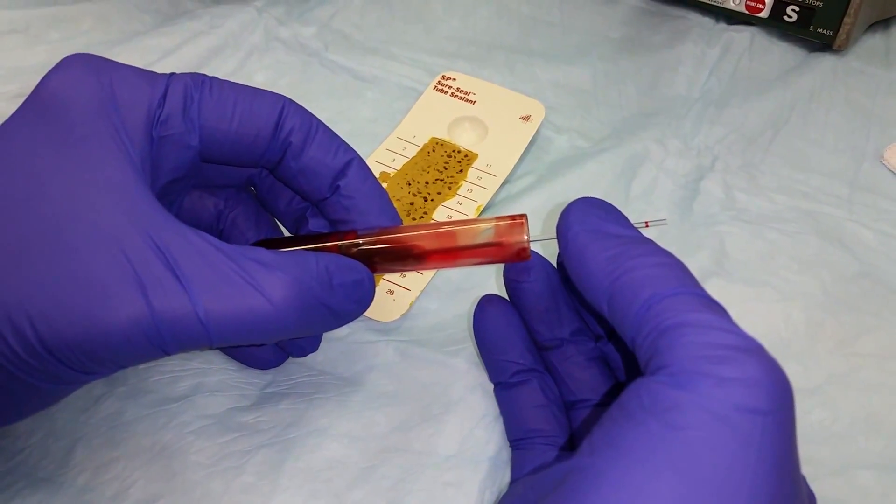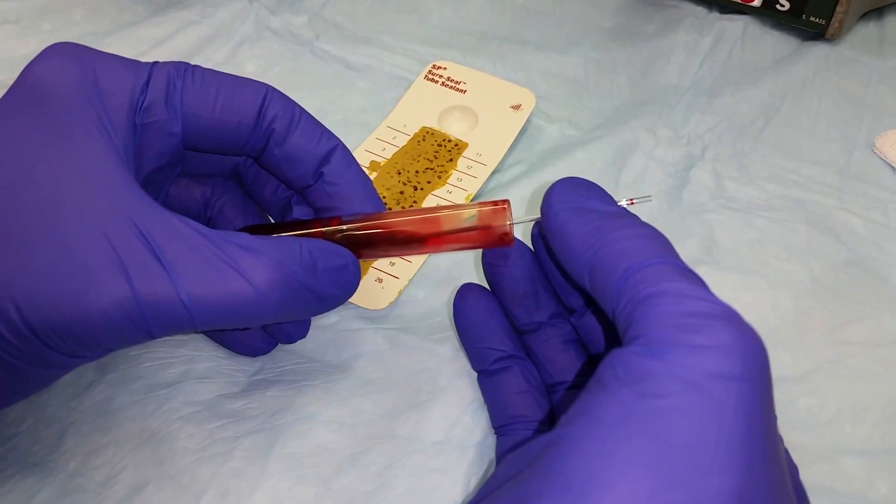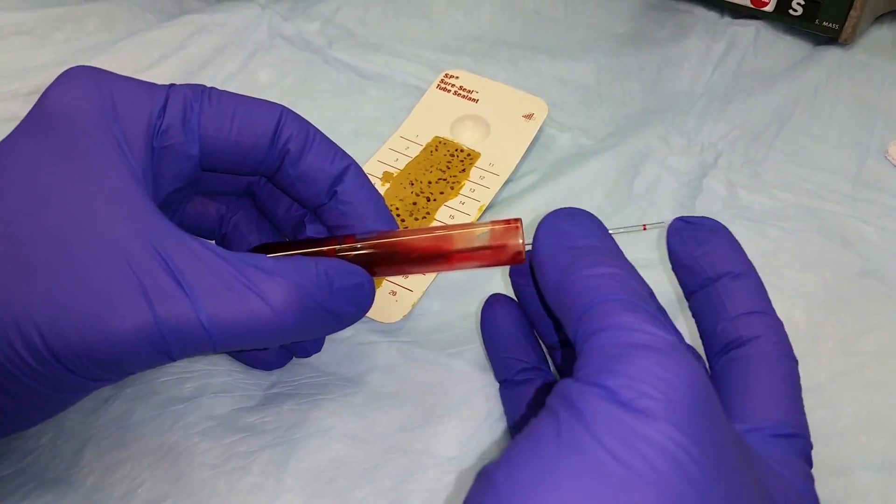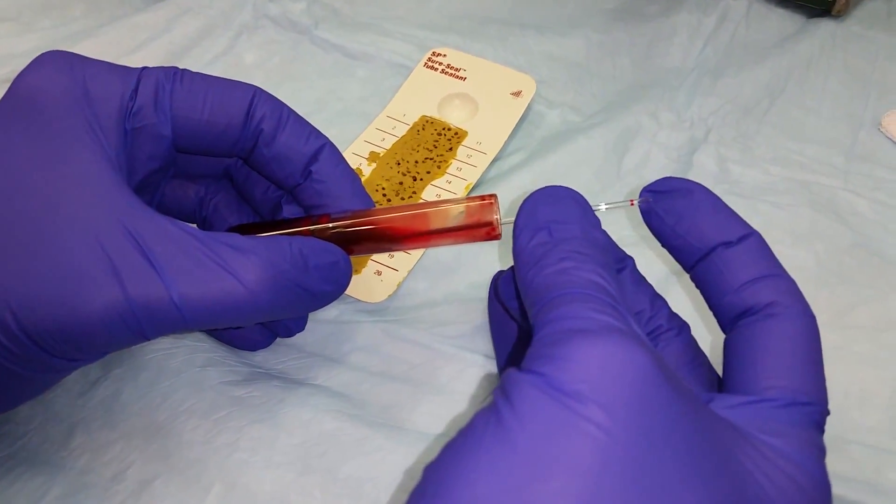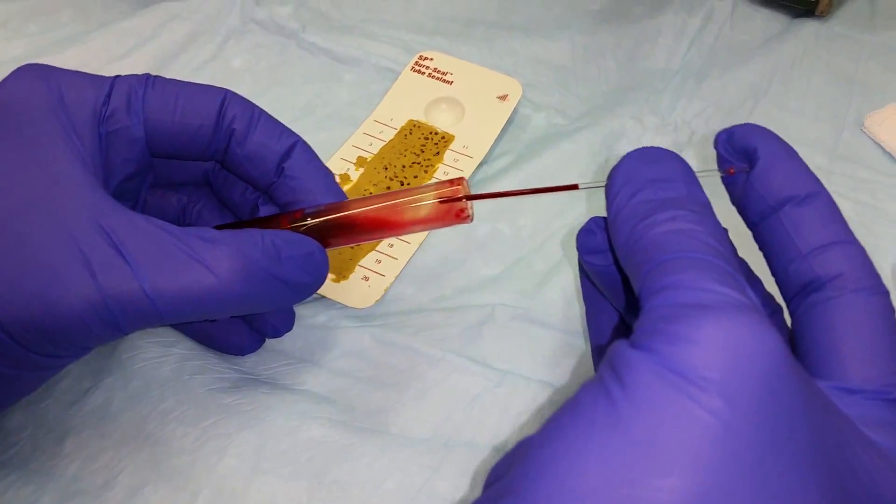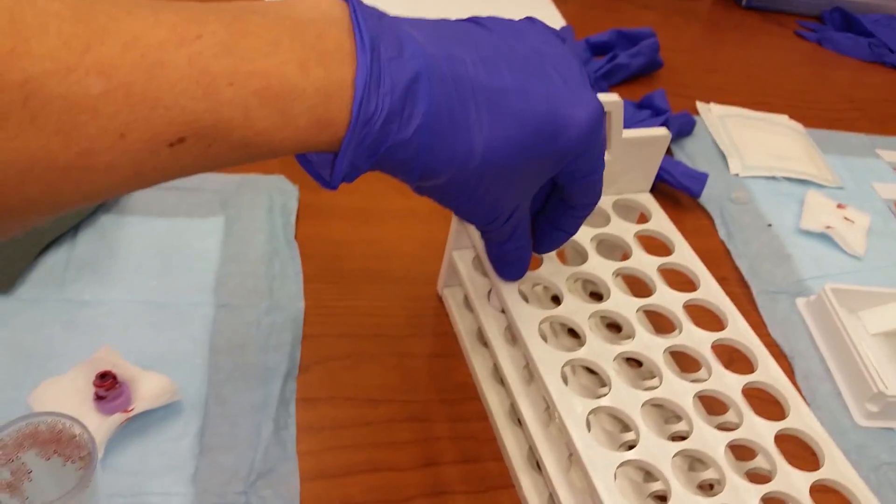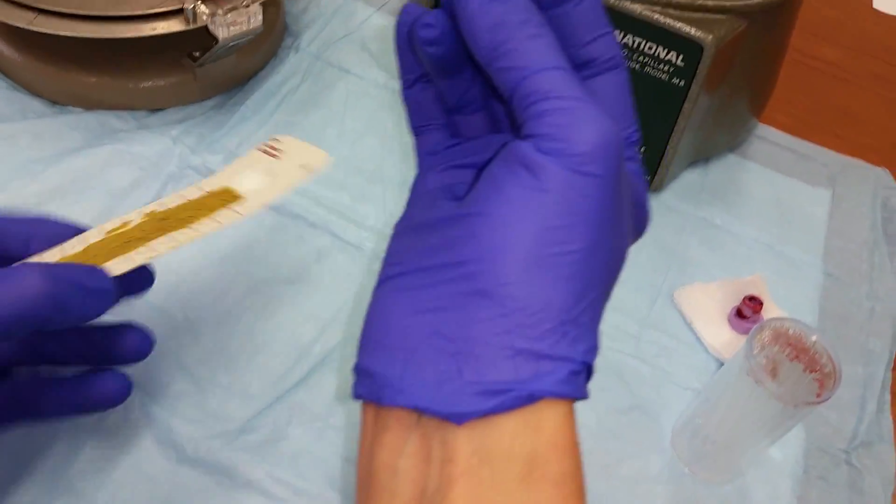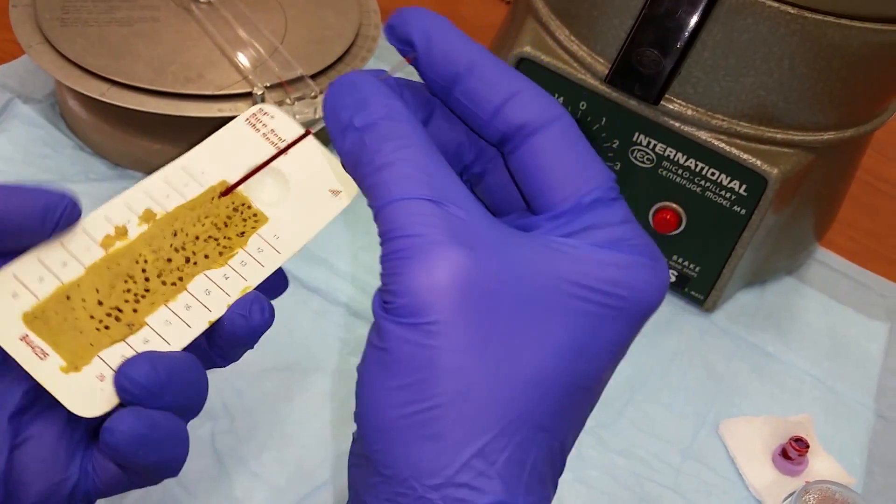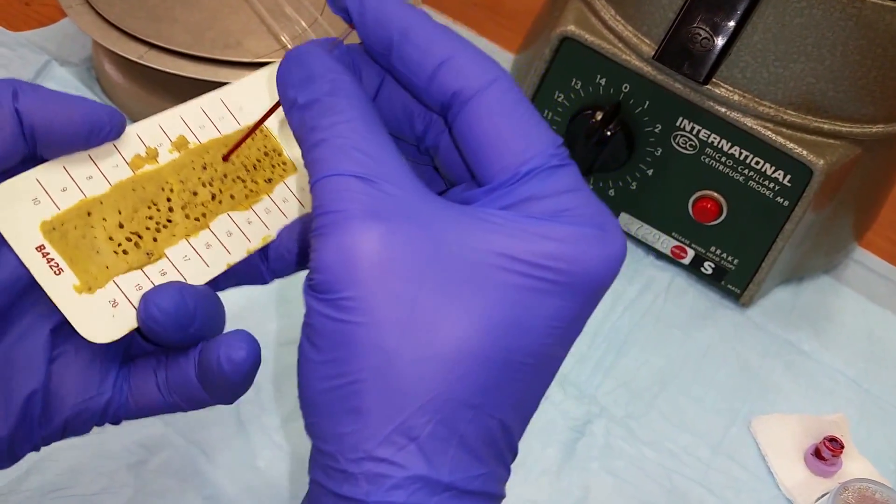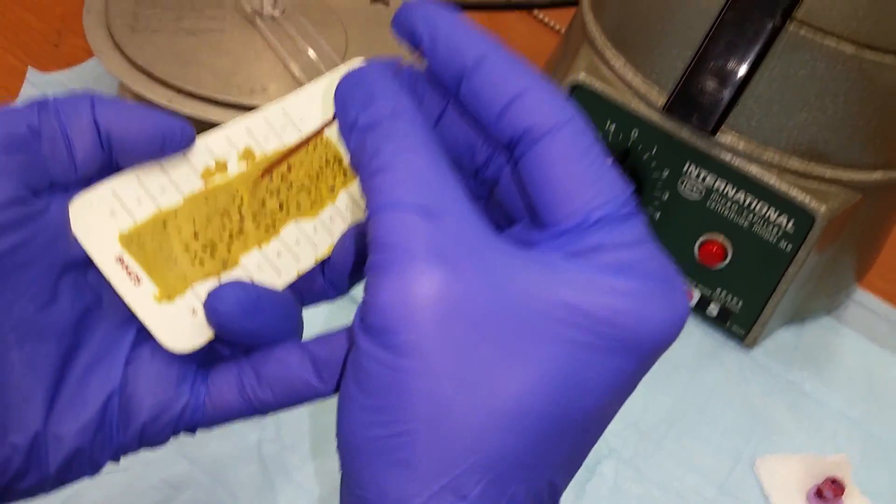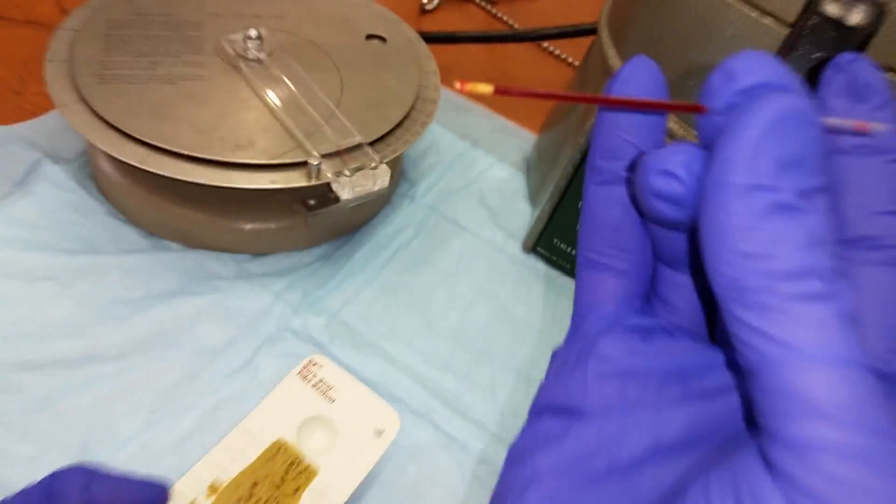Once the blood has reached about the halfway point, before you remove it from the tube, you want to place your index finger on the top of the tube, and then you want to cap the bottom of the tube by inserting it several times into the clay, which will then cap the bottom.